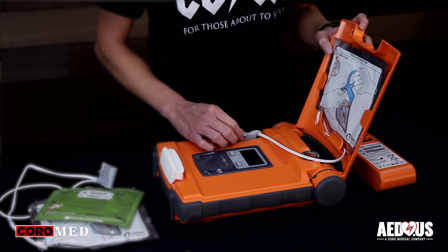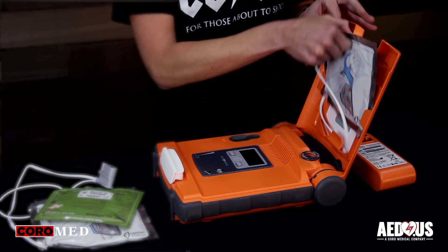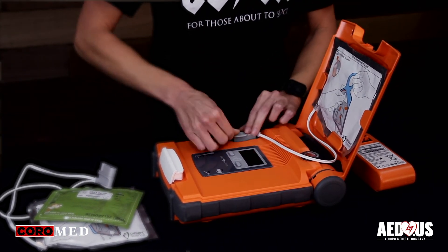To install or replace the adult electrode pads, open the lid, pull the old pads out. You're going to take the new pads, plug in, and slide it through this window. Just a little tip: the Cardiac Science logo goes to the bottom right.